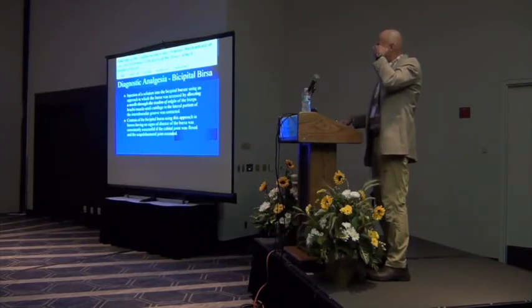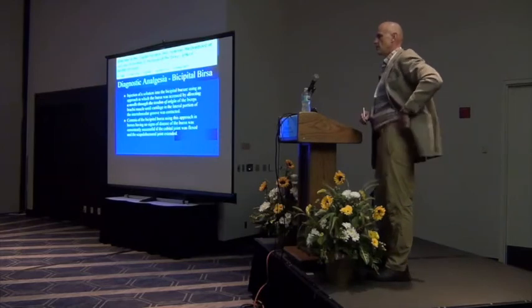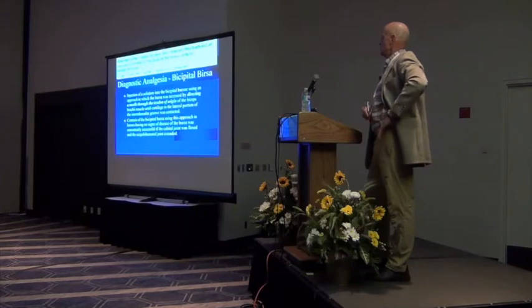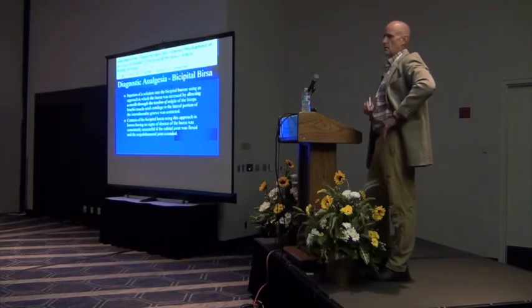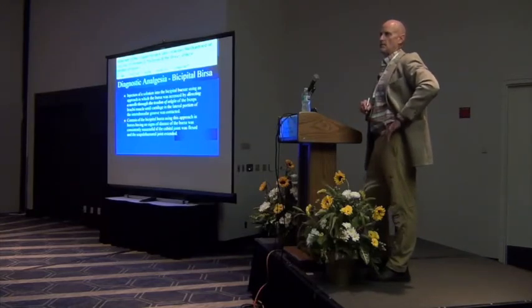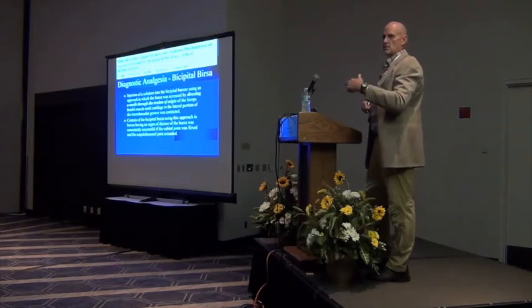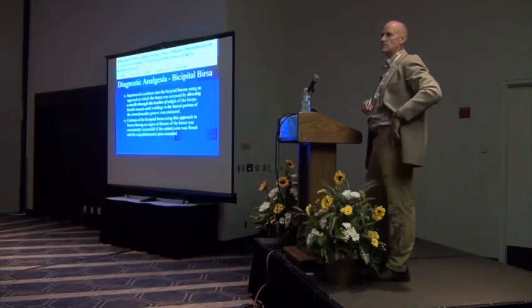This is Schumacher. And the Schumachers are always intriguing to me in some of the ideas they come up with. They wanted to come up with a way to more appropriately inject the bicipital bursa that did not have fluid in it. So their rationale was to pick the leg up and extend it and then drive the needle through the tendon. And that's probably a pretty good way to get them in there. I guess I would just be a little bit reluctant to have an 18 gauge needle sticking through the biceps tendon and have the horse start to struggle. I would probably be concerned that I could create some problems that weren't there when I started.